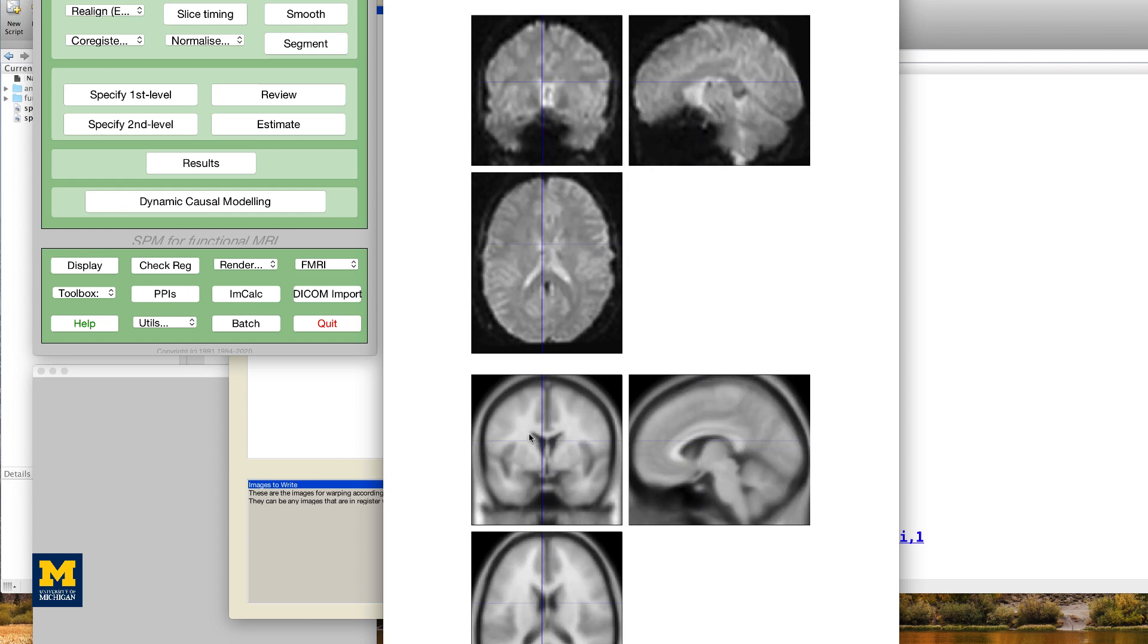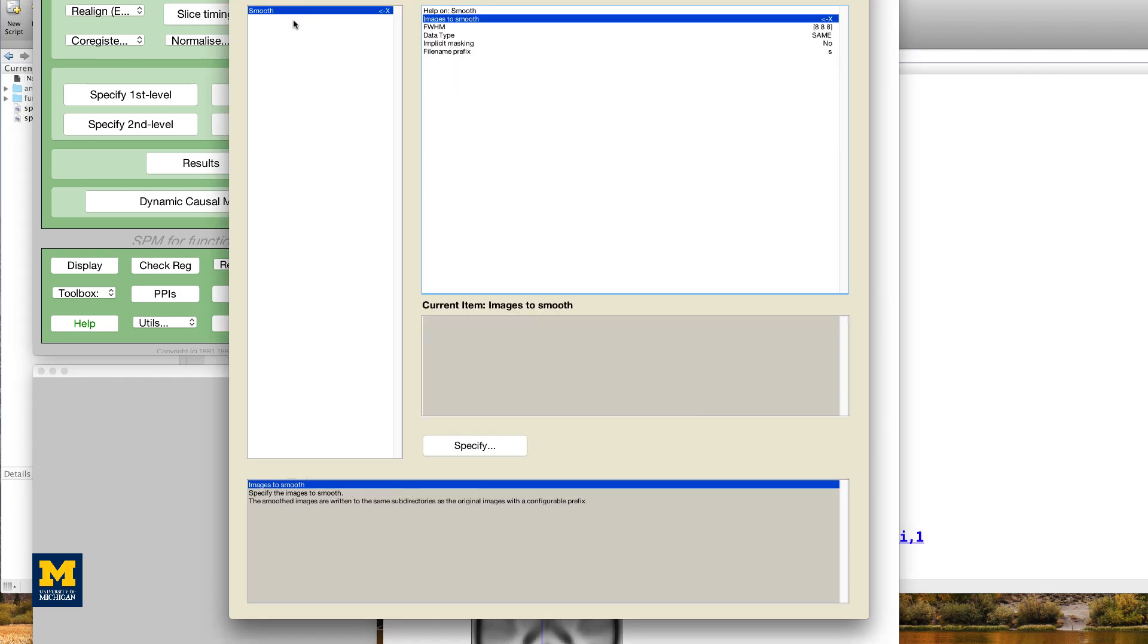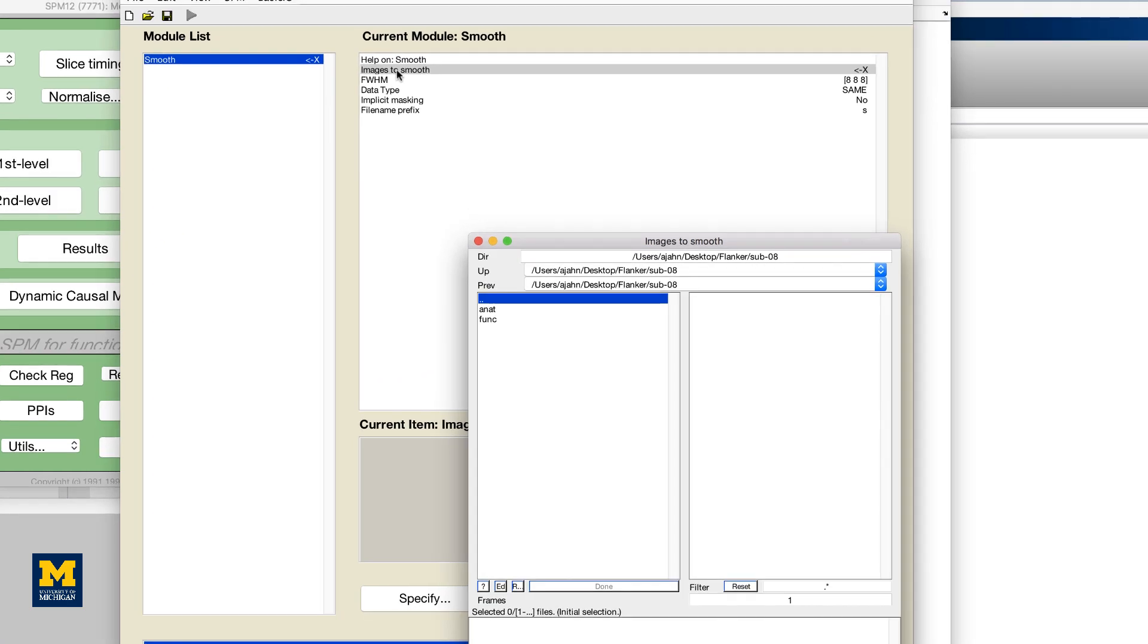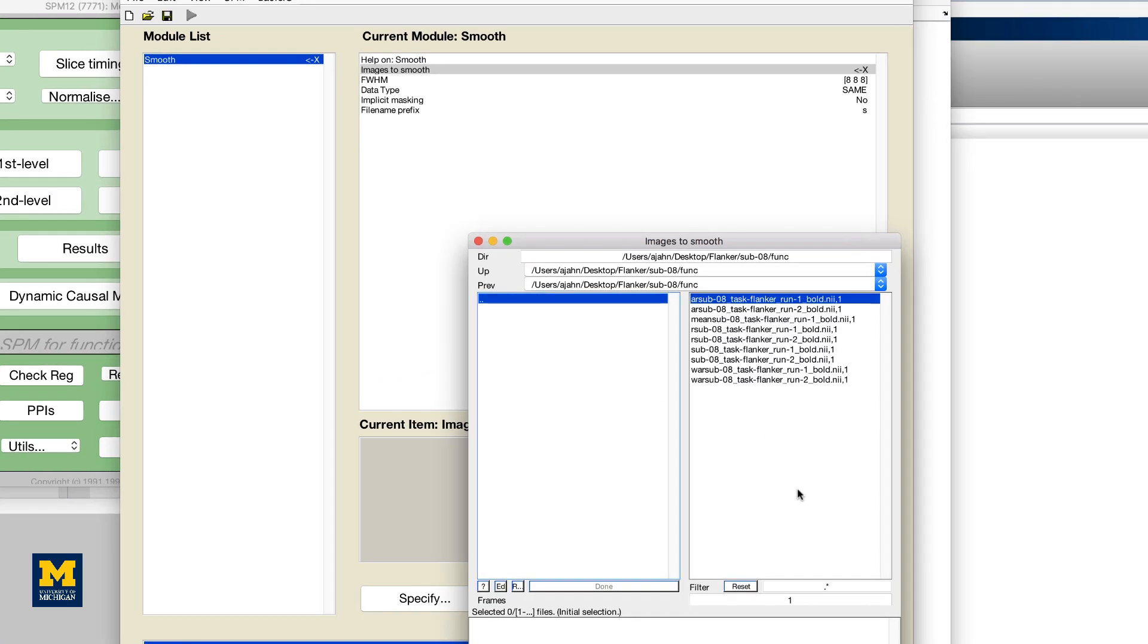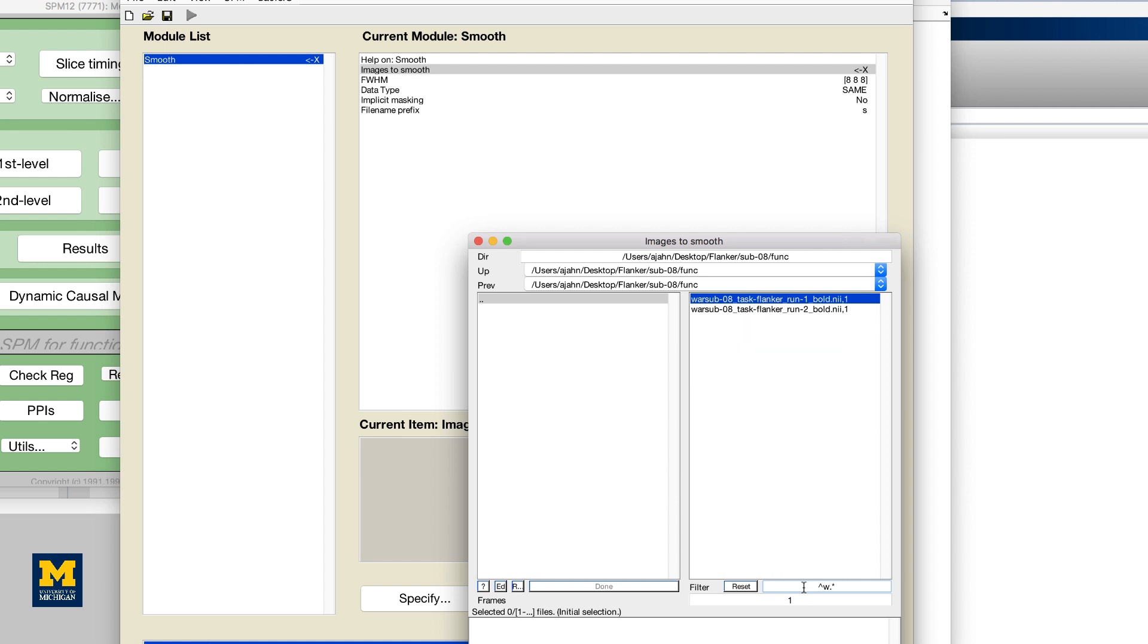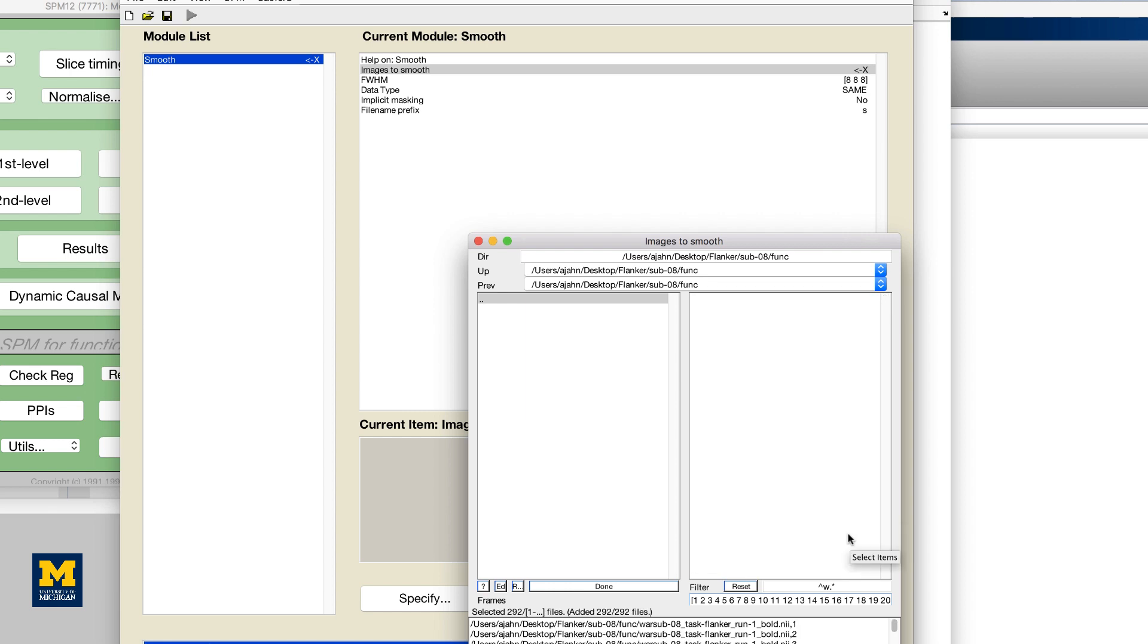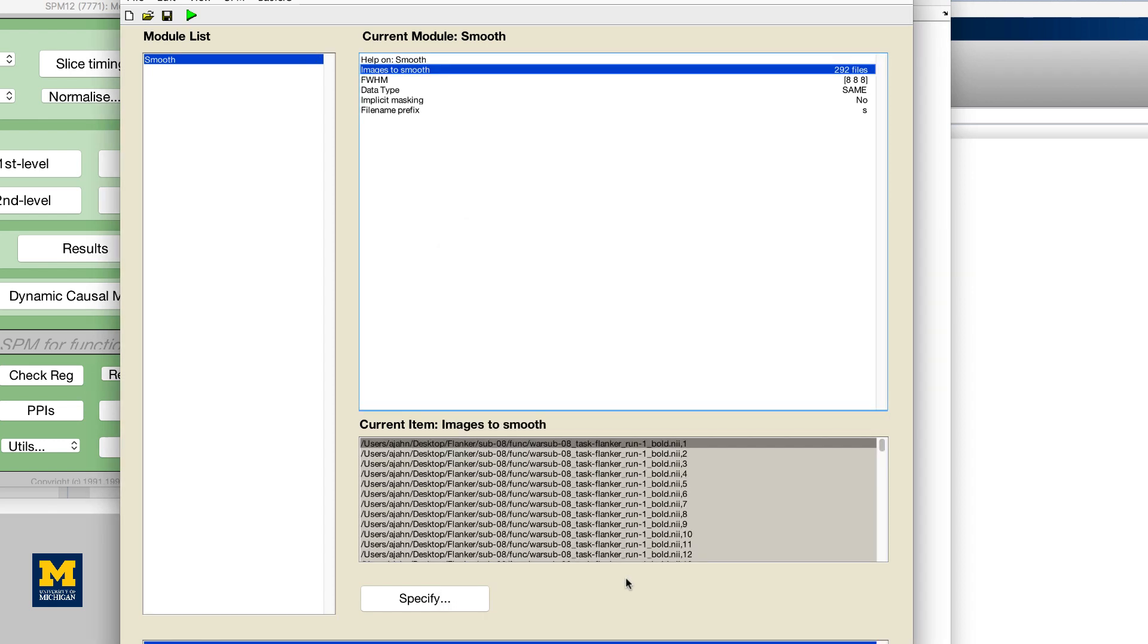The last step is smoothing, which averages together signal and cancels out noise. Click on the smooth button and then double click on images to smooth. Select the warped functional images and expand them to include all 146 frames for each run. Leave the other defaults as they are and then click on the green go button.